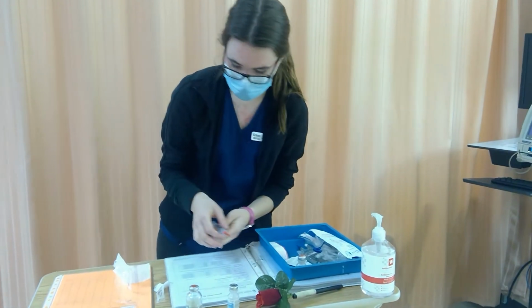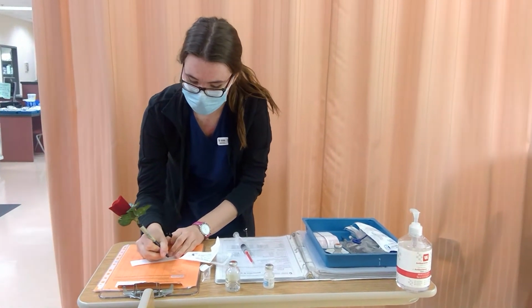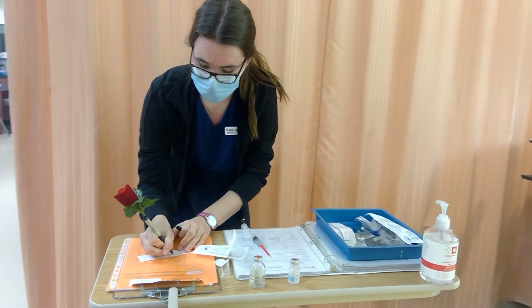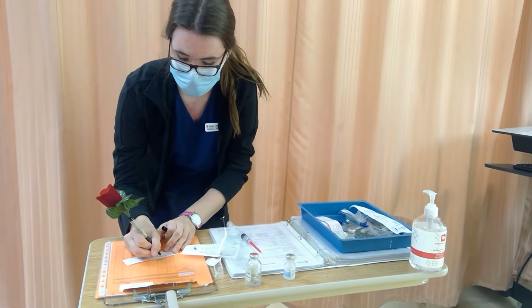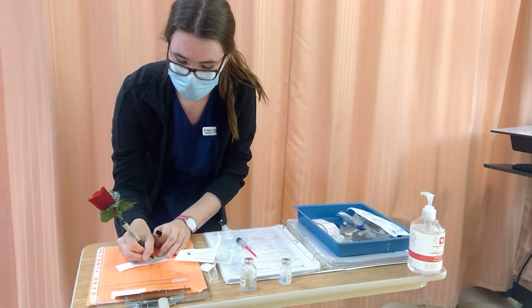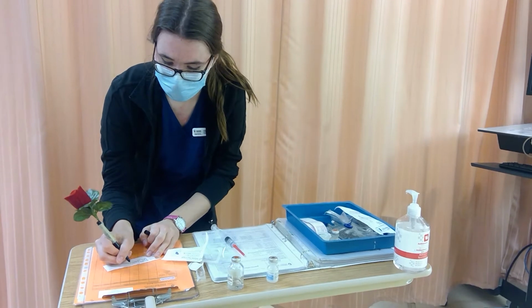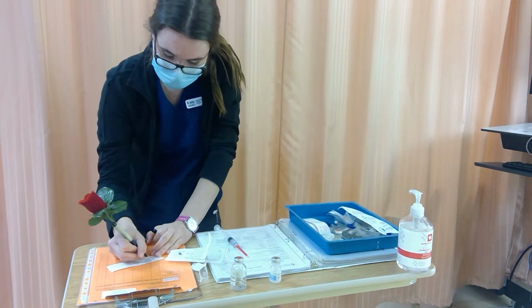And now that I have that, I'm going to actually make my label now. That's a personal preference of mine. I like to have it during my second check. So my correct patient is verbalized, drug is penicillin, dose is 2.5 million units, which is a volume of 5 ml. We're going to be diluting it in 100 milliliters of normal saline. So we're going to be bringing that to 105 milliliters of medication.